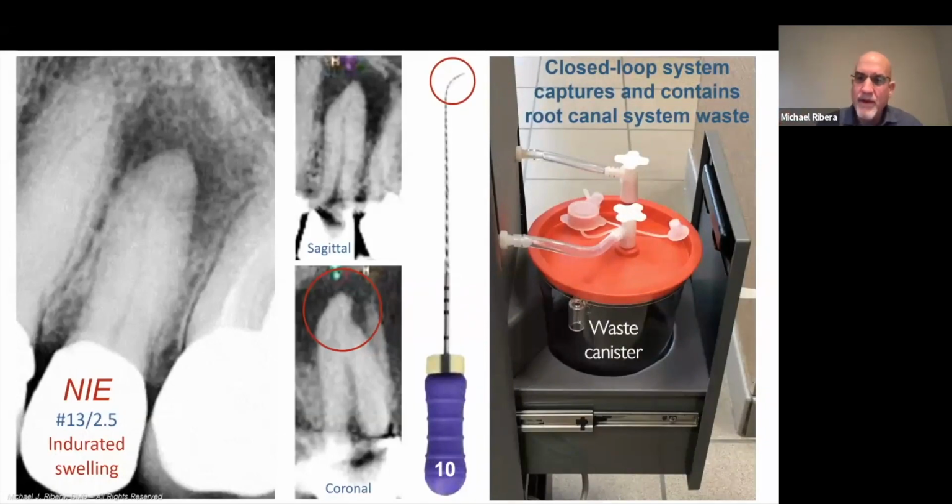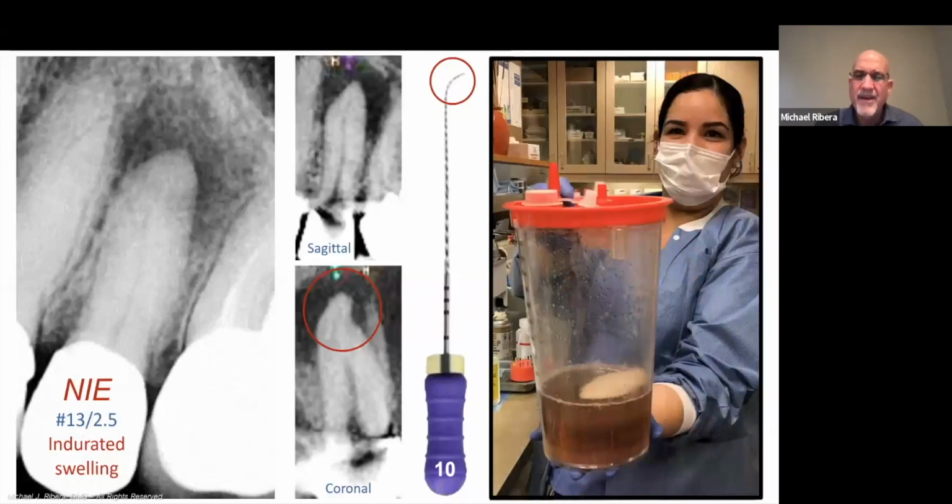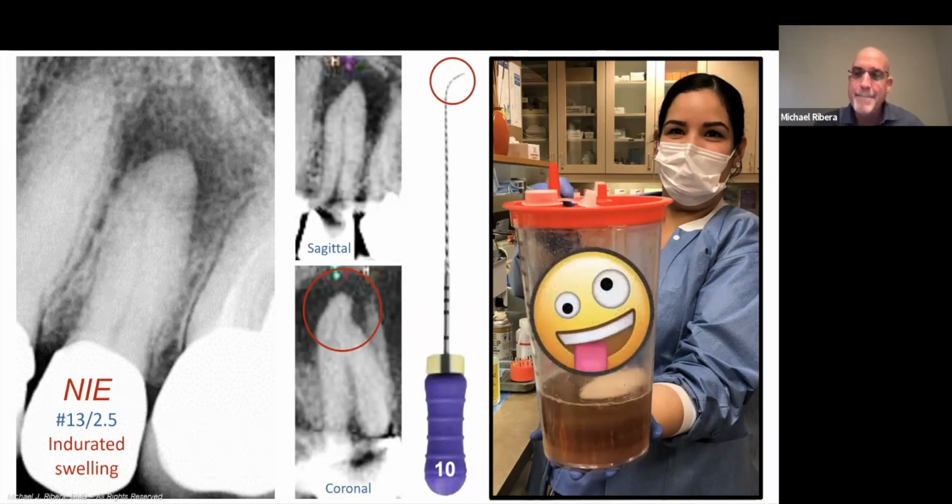It collects the waste. So we remove the rubber dam, sit the patient up, and the patient says to me, "Hey, doc, oh my goodness, I feel like everything is back to normal. All that hardness is just not there. Wow, this feels so good." Well, Mr. O'Brien, let me show you where the brick that was inside your jaw is. It's right there. That's where the brick is. We sometimes take images of these canisters and show them to patients to let them know what exactly we did and why we're using the technology that we are using on them.